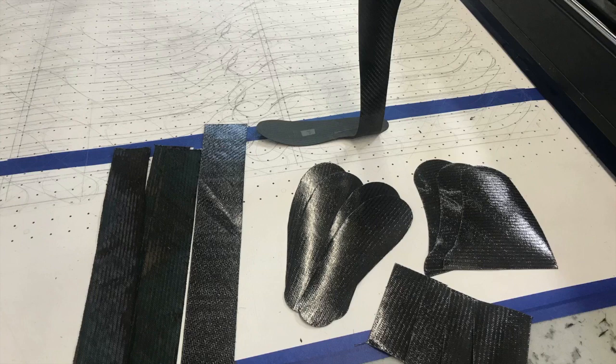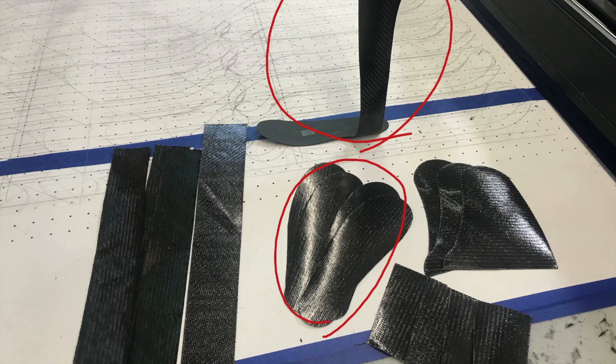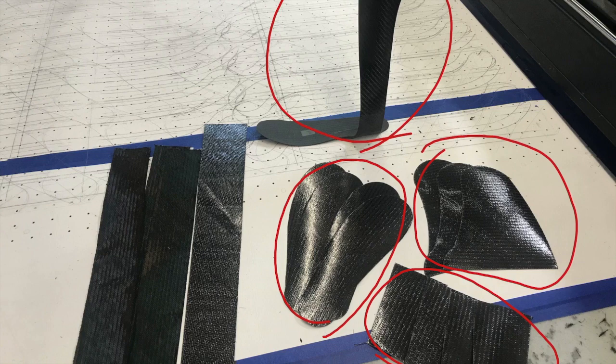Composite AFOs, on the other hand, here's an example right here of our posterior lateral strut. It is composed of a number of different pieces that go into the foot plate. These also go into the foot plate as well. A number of different pieces go into the calf band, and there are a number of strut materials that also comprise the strut portion of the brace. These are different types of carbon fiber, and they all have a certain purpose: to make the strut stiff and the foot plate progressively flexible.